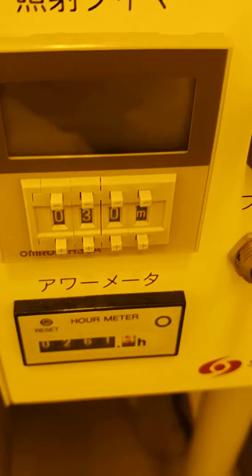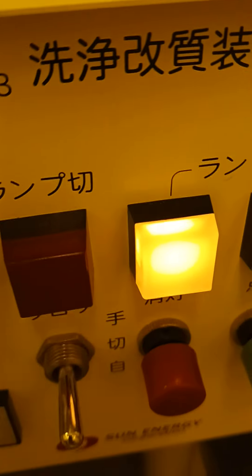If we press the minus button, it goes back to 30 minutes. So you can increase or decrease the time using this part.